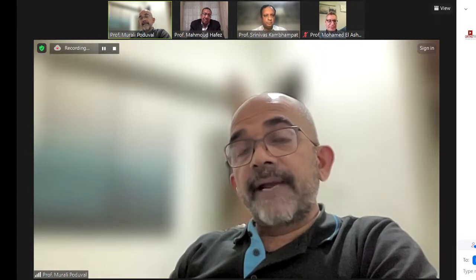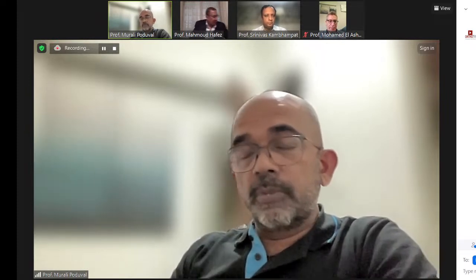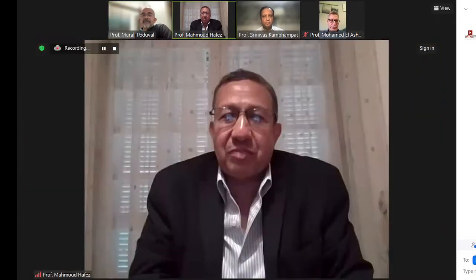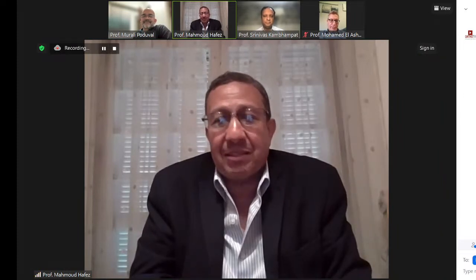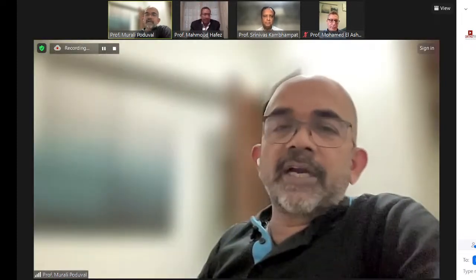Now, despite the fact that most people are talking about the bony preparation part of robotics, I believe the more important part of robotic surgery, which Professor Mohamed will definitely agree, is decreasing the need for soft tissue release. Right, sir? Definitely. Yes. I have now lost the skills of soft tissue release. I don't do it, rarely, honestly. Really nice. Surgeons using conventional technique can't believe this statement when I say it. But the need for soft tissue release is getting less and less.